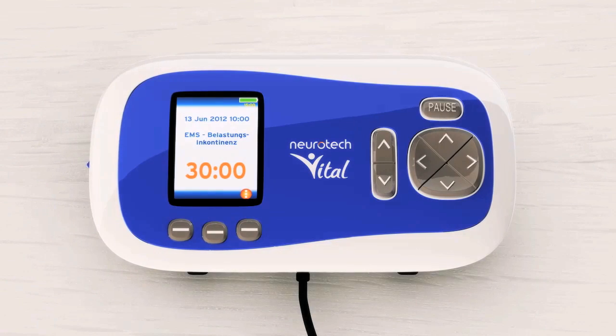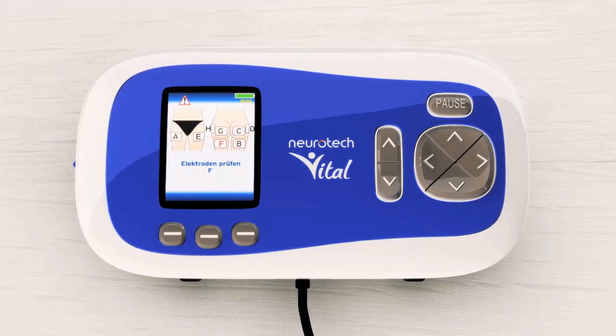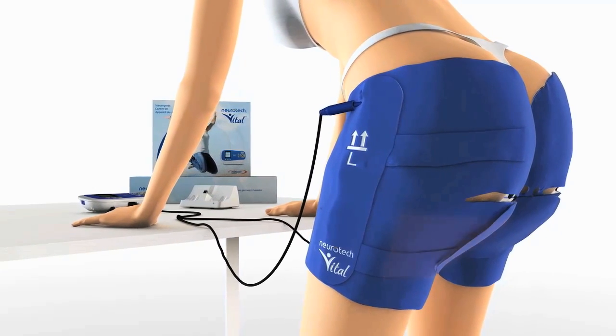If any of the electrodes do not have adequate skin contact, those electrodes will be indicated on the display. Correct the position of the thigh garment and start your session again.